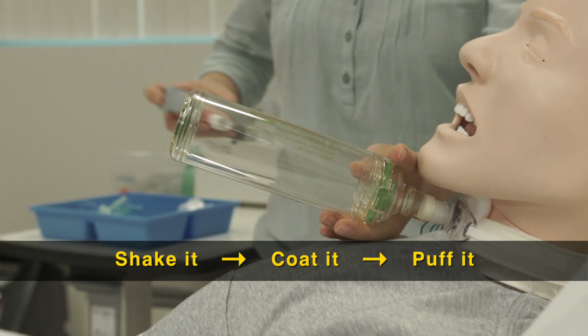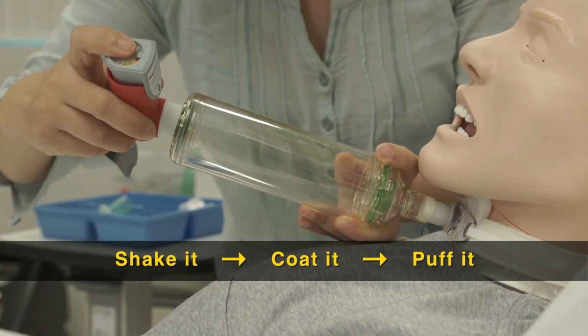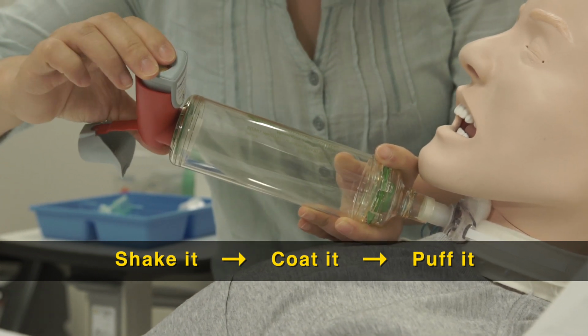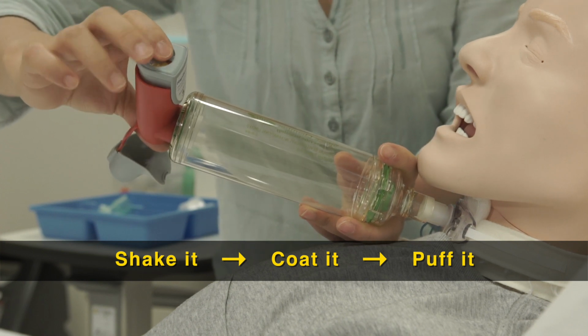Instruct the patient to breathe in and puff the inhaler at the same time. Allow 3 to 5 breaths before the next puff. Administer the prescribed number of puffs.